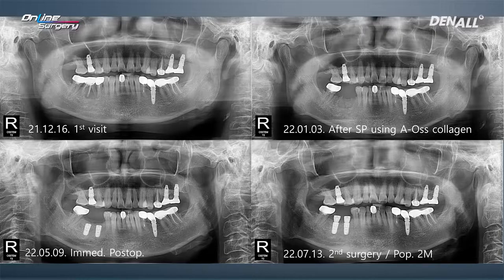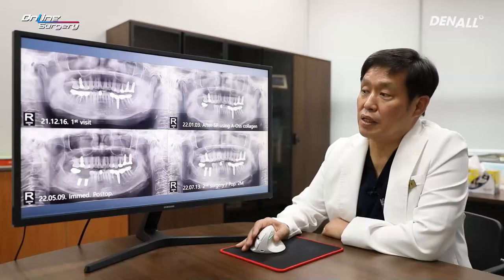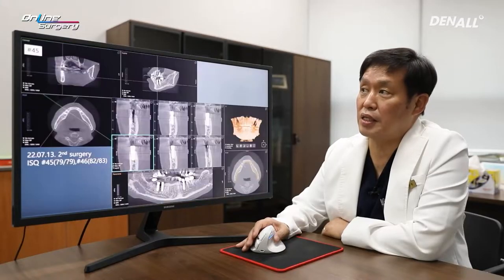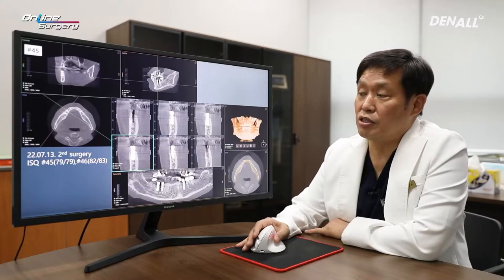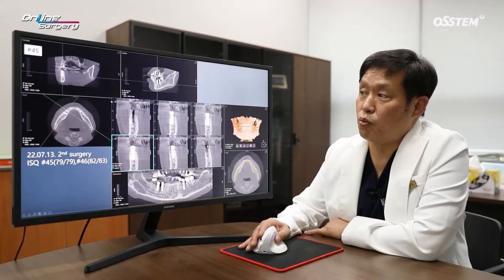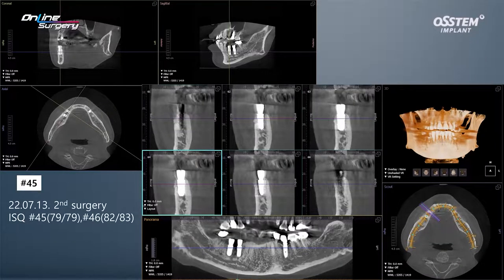About 2 months later after implant placement, healing abutments were connected and impression was taken. At the time of second surgery on CT in number 45, you can see that the bone is not fully consolidated but a favorable buccal wall can be observed.